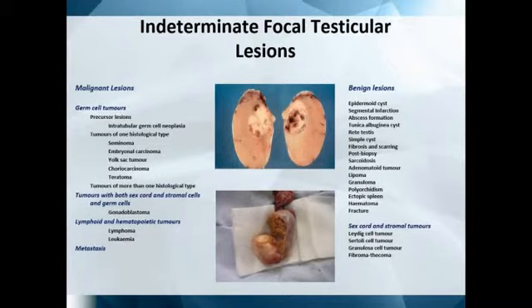First of all, a lot of you have been ultrasounding testes for a long time, and you have this general feeling that all the testicular lesions that you see are going to be cancer. But this is not the case. The teaching is that 90% of the lesions that you find in the testes are malignant, but this is based on old data. In the old days, before you had any ultrasound, you never found an incidental lesion. You palpated that lesion and it was going to be malignant. But there are also many, many other benign lesions.